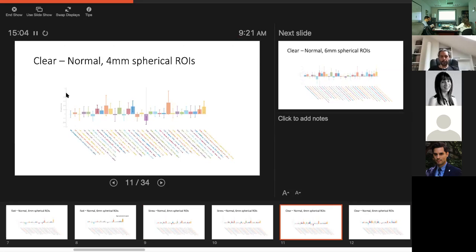So for those where we have individual ROIs, once we have that capability, that's the way to go. And then for these other ones that are smaller, where we just don't have that, we resort to using the subcomponents and just hope that they pop up.